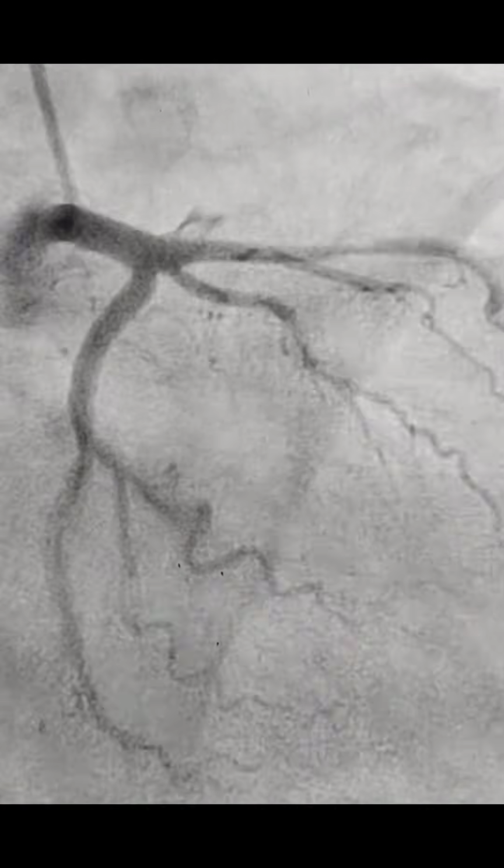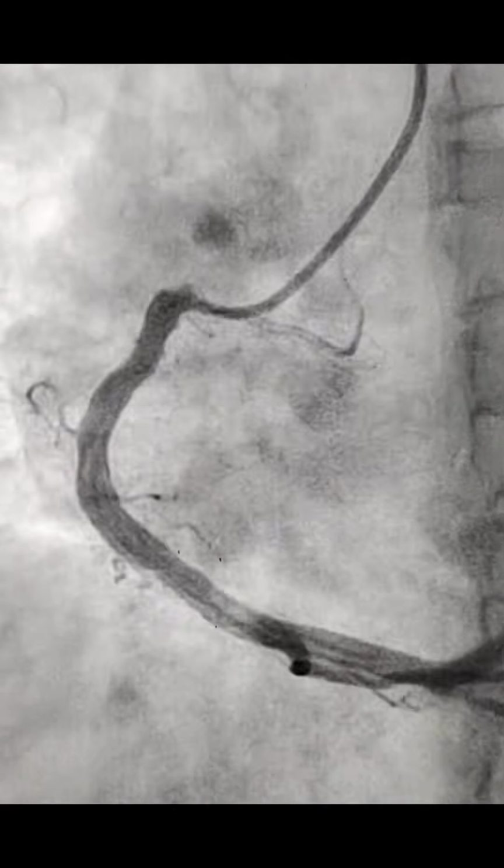So this is the caudal view, and this is the cranial view. You could see the same thing. There is an ostioproximal thrombotic occlusion in the major LAD, and the second LAD is having a proximal thrombotic occlusion, and the ramus is normal, LCX is normal, and RCA. This is the RAO cranial view, and the same thing you could see here. And this was the RCA, which is dominant and normal.